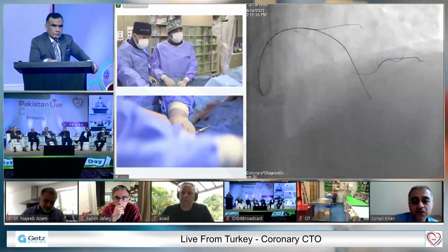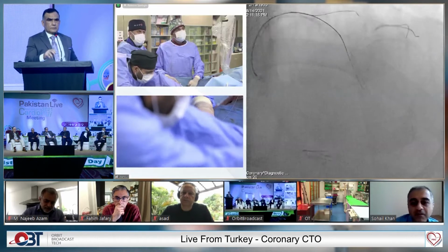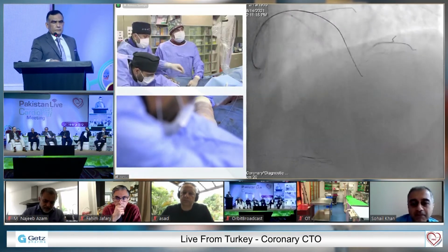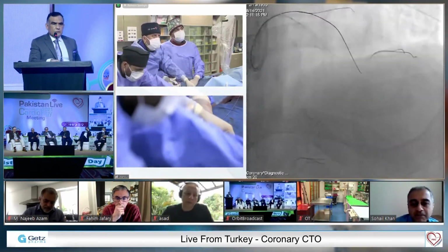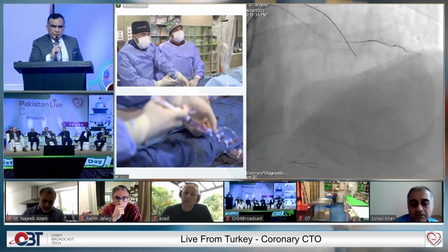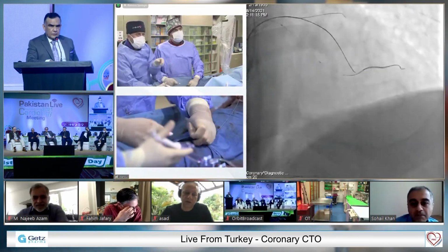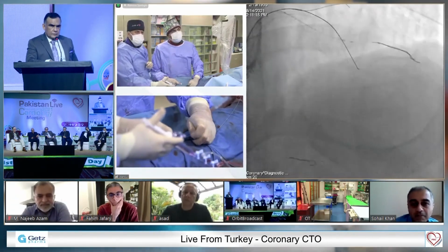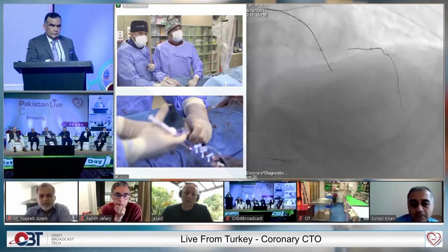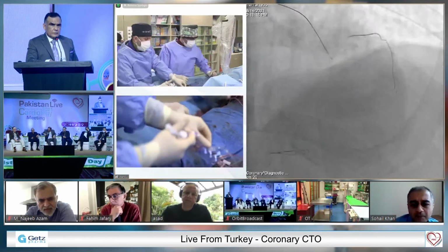So which wire have you got now? This is BMW for searching the collateral. Which wire? BMW, this is just to go to the side branch of the collateral. Yes. Okay. Here I have a nice collateral.